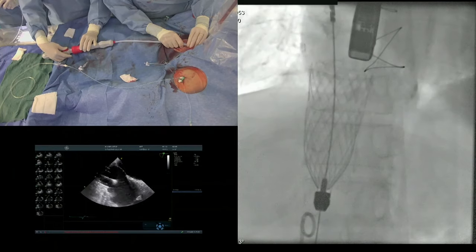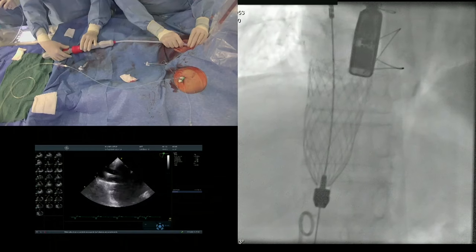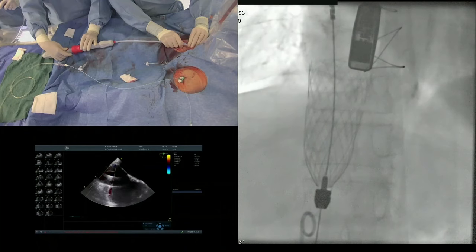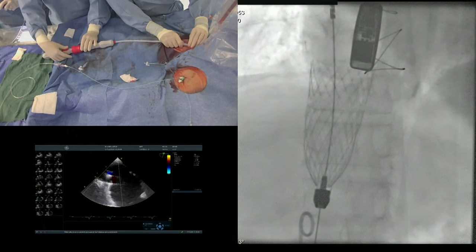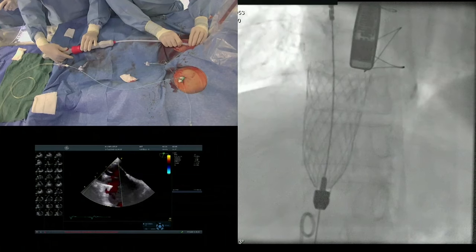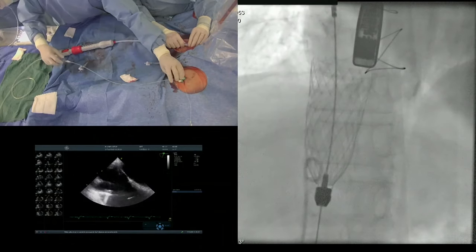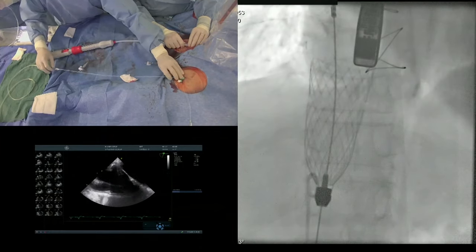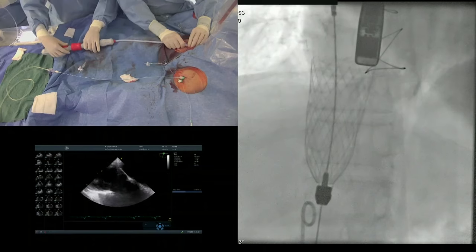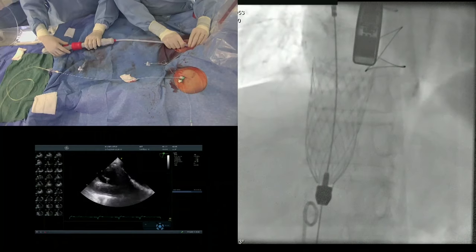My echo is 0.8 centimeters. Okay. Now, okay, don't make tension now. Almost at the point of no return. So we are completely short. This is the position. Yeah, I think it's the position. 8 millimeters, no? The last measure? Okay, 8 millimeters. Fine, no? Okay. We follow the release.